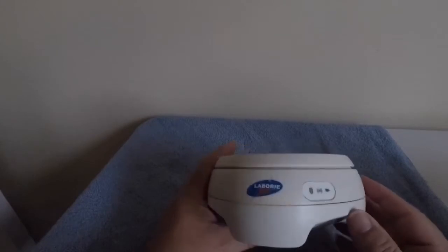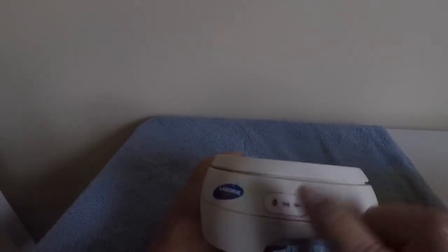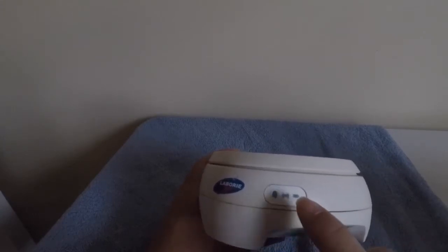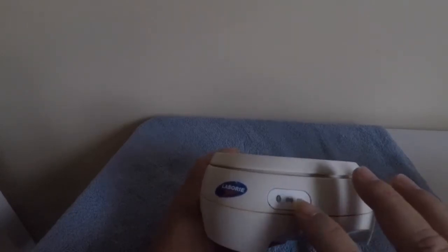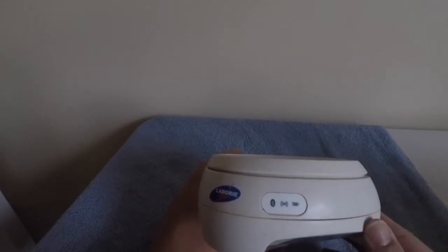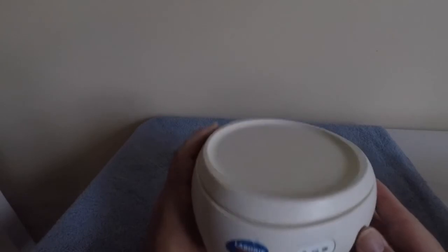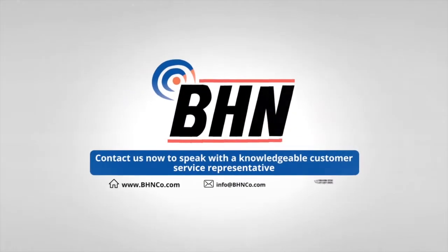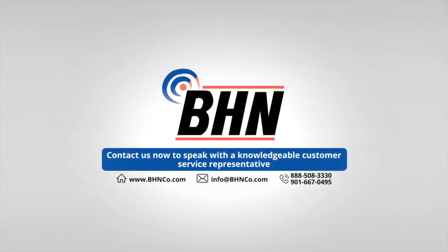I hope you found this short video informative. One thing to mention about the status lights: if you need to troubleshoot for any reason, the Gobi manual has a list of what the lights mean, which will help you troubleshoot. Most likely you can simply call Laboree support and they will help you figure out what's wrong with the unit. Contact us now to speak with a knowledgeable customer service representative and have all your questions answered.